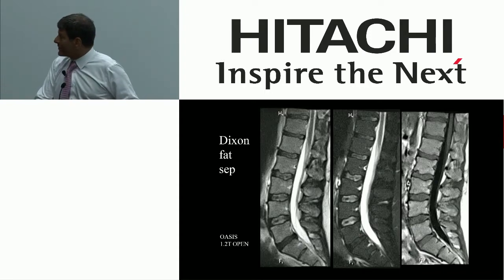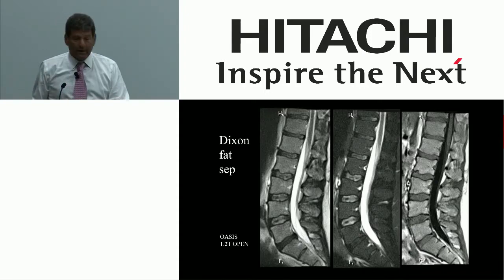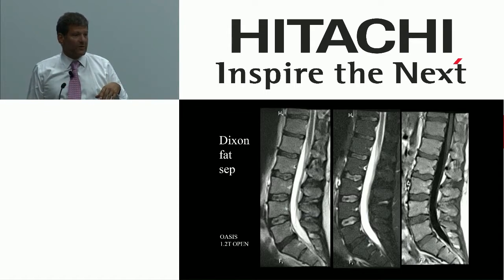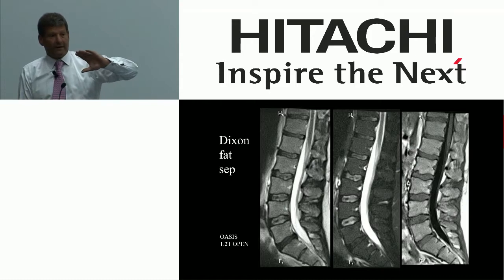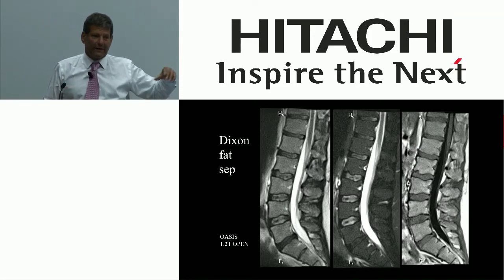Same thing in the spine. If you're a fat suppressed spine facility, you can do a T2 with and without fat sat. In any radiology group, by the way, there's a lot of division about fat suppression. Some guys may want their T2s fat suppressed. Some guys may know there's a trade-off to that. You do them with Dixon, you give them both the same thing at the same time.